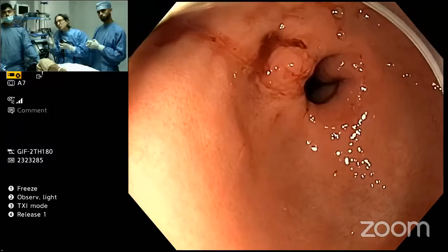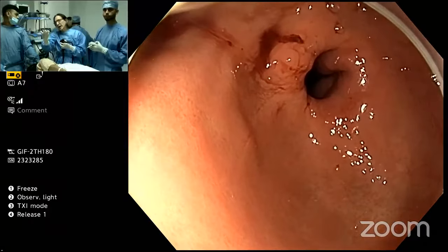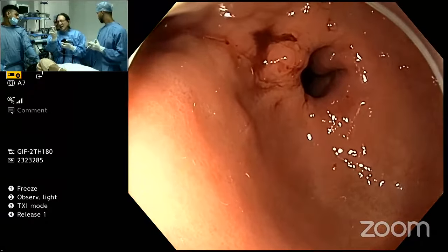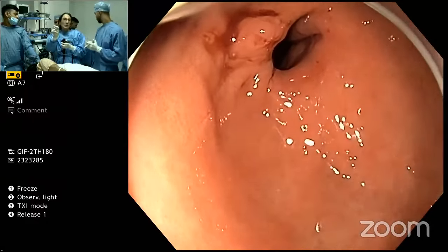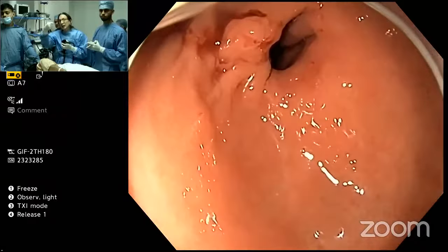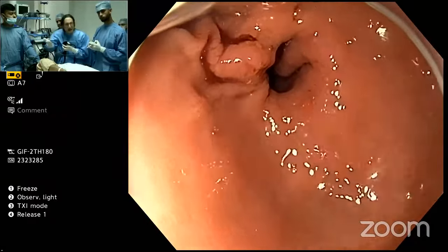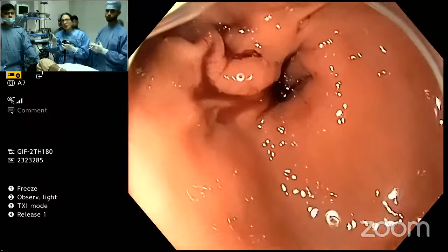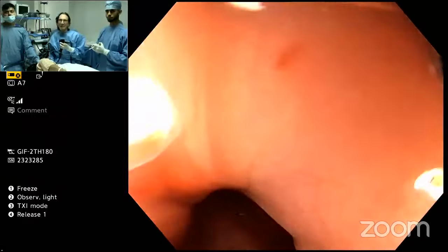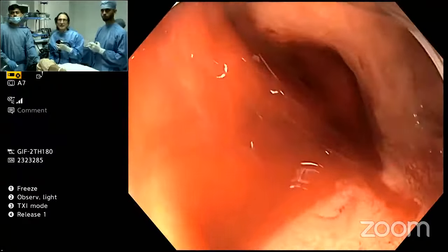And that's another reason why I like to have the loop really flush with the bowel wall, so that when I do my resection, my cutting, I'm at least 5 to 10 millimeters above that, 5 millimeters above when I close. That way you don't risk catching the loop, which can make it difficult to cut through, but at least you can cut through if you needed to. But it also gives you the ability to keep the loop in place after you cut, because you don't know, there could be a vessel in there that suddenly starts bleeding on you.